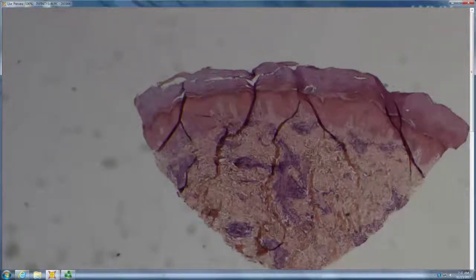Okay, how about this? So this almost has the... Are these flame figures? They are flame figures, with granuloma or without granuloma? It looks like they might have granuloma. Granuloma would be pretty obvious. Okay, yeah, so they're without. So this is Wells syndrome. Wells syndrome, and what is Wells syndrome? Arthropod reaction, and we say that just because it's not always a bite.